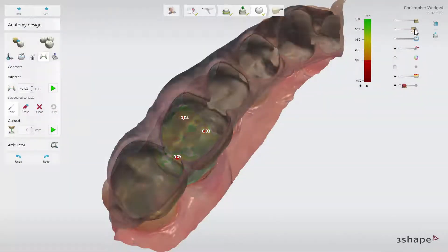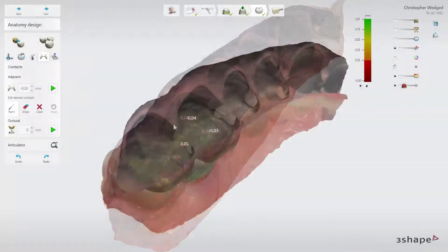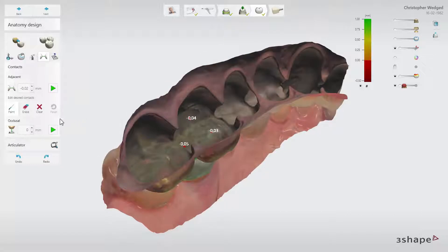The Occlusal Contacts tool allows you to set the value of occlusal contacts. Please remember that it only has the possibility to cut material to get the desired occlusal contact point — it does not add material to build up the design to the contact. Once set, click the Play button to have it applied.